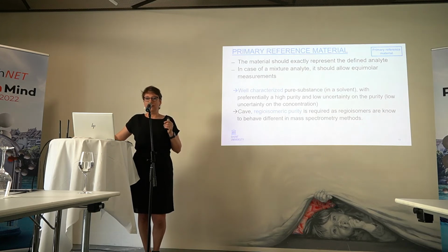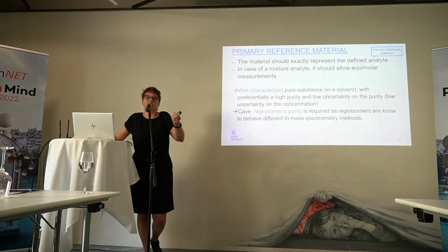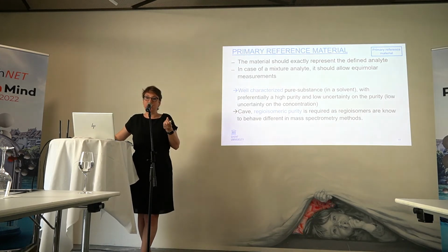So, the primary reference material should exactly represent the defined analyte, and in case of a mixture analysis, it should allow equimolar measurements. So it should be a well-characterized pure substance, either as a powder or in solution, and it should have a high purity and a very low uncertainty on the purity, or it should have a very well-defined concentration and a low uncertainty on that concentration.